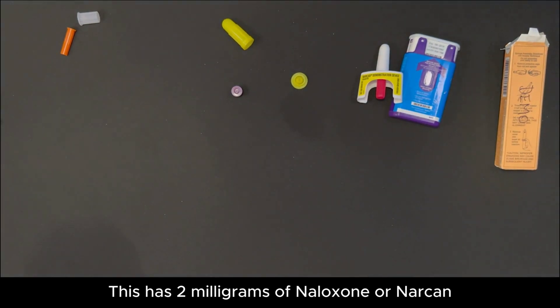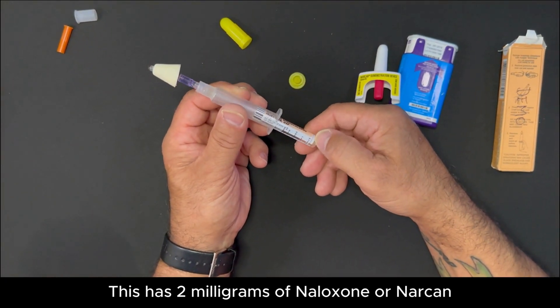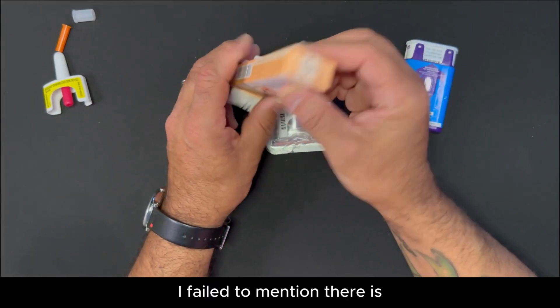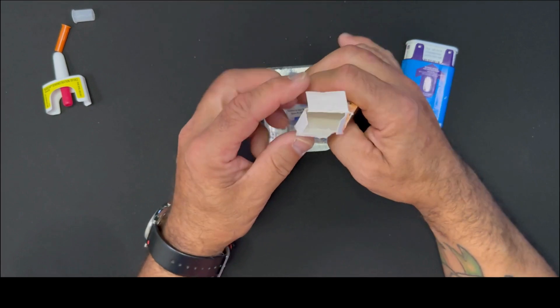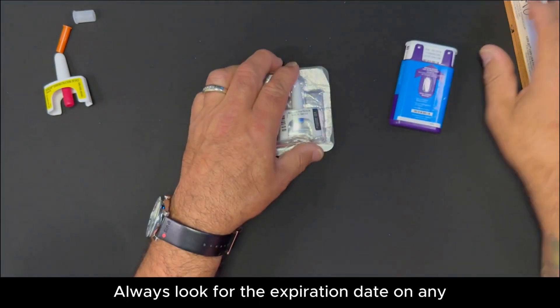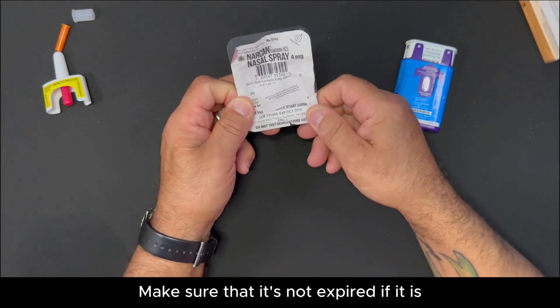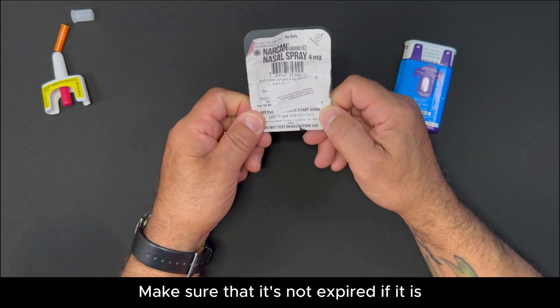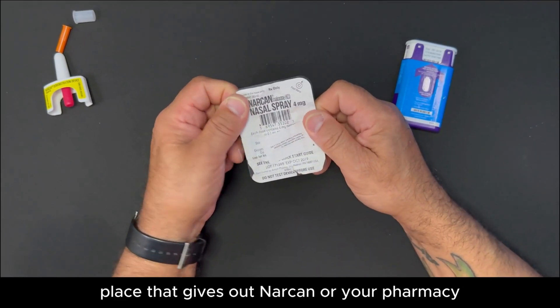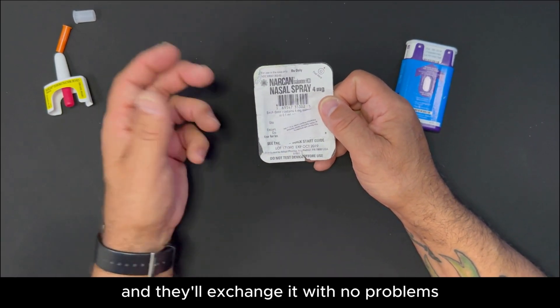This has two milligrams of Naloxone or Narcan. Always look for the expiration date on any delivery system. Make sure that it's not expired. If it is, go to your nearest place that gives out Narcan or your pharmacy and they'll exchange it with no problems.